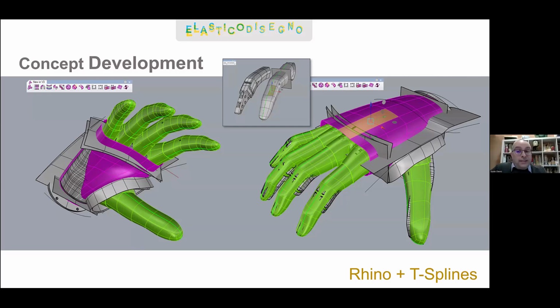And it was sure no easy task, considering that, for example, the thumb contains a motor and a gearbox, so that's pretty bulky. And the index and middle fingers are the same, while in a human hand they are different sizes. In this case, they had to be the same size because they both host a whole set of sensors on the inside.